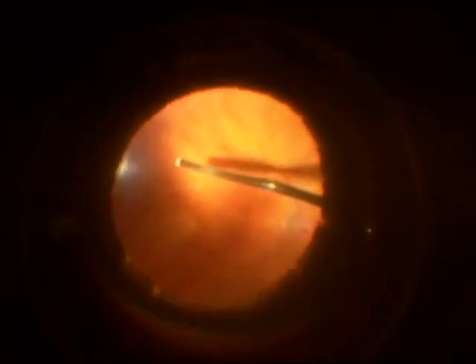Here you're seeing the vitrectomy. The vitreous can be seen in the light pipe — it's the cloudy substance on the left-hand side of the picture.